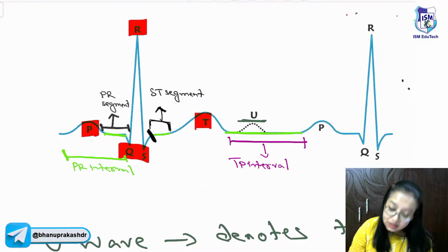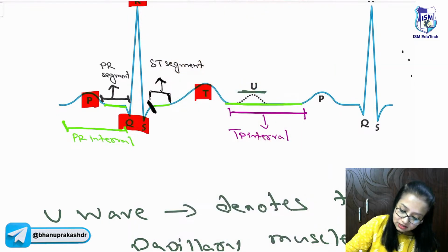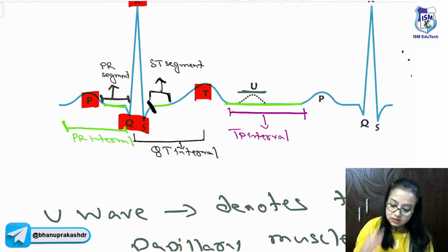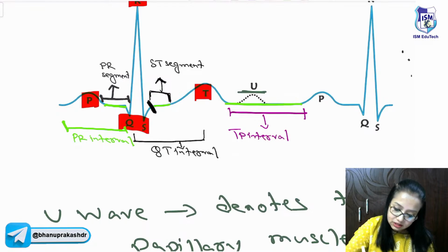Okay. Another interval that is also clinically relevant is the QT interval. Basically, after depolarization, the repolarization phase of the ventricle. It includes the QRS complex, because it is the QT interval: the QRS complex, the isoelectric line, the ST segment, and the T wave. Okay, this is one.